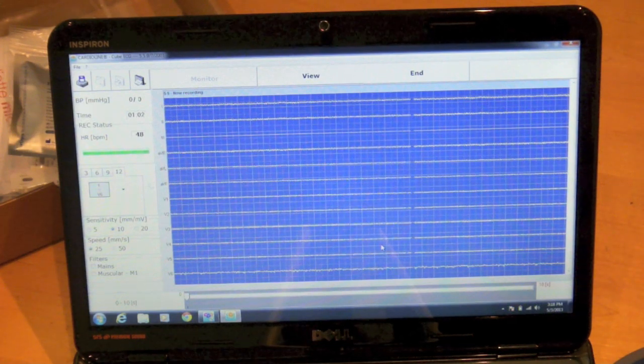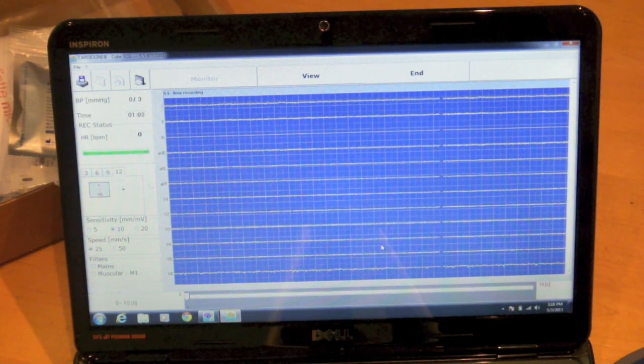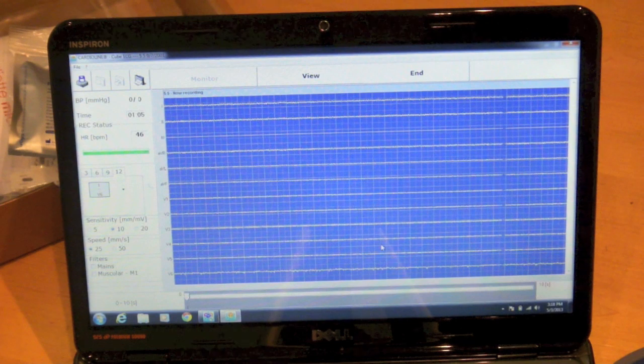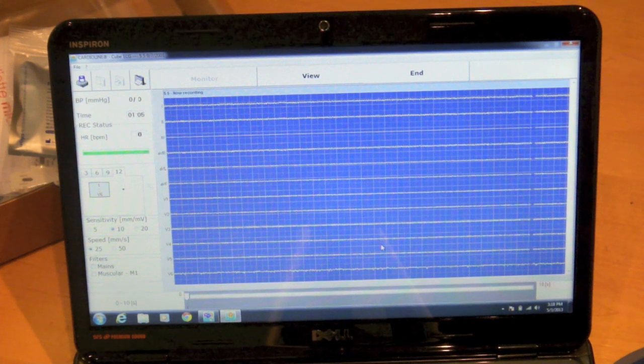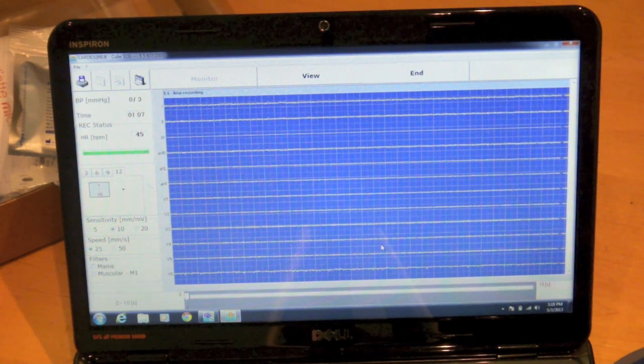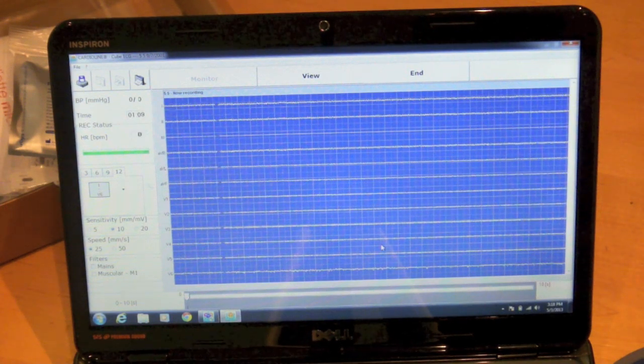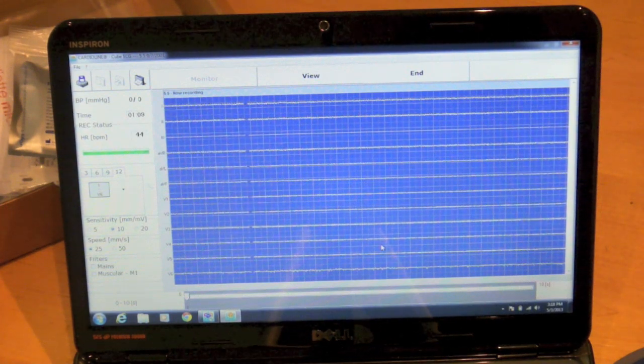From here you can save a 10 second strip and get a full page interpretive report that you can save as a PDF and upload to your EMR.